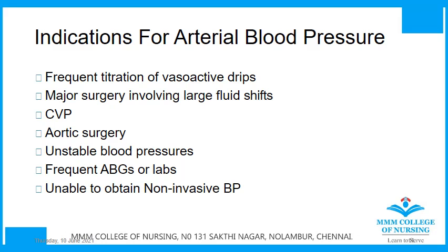That is, for hemodynamic stability, what drugs we are giving. We can also look into continuous arterial blood pressure monitoring, and we can titrate the dose or amount of the vasoactive drugs which we are giving to the patient. Next, major surgery involving large fluid shifts in the body.